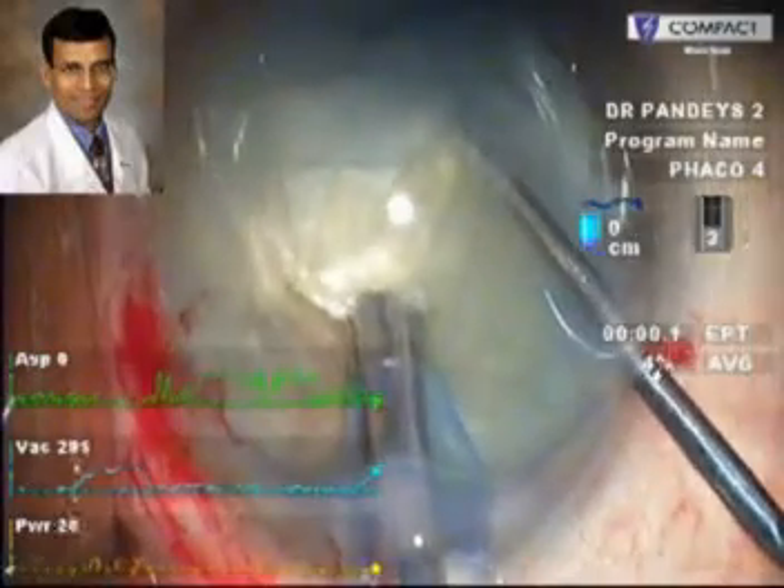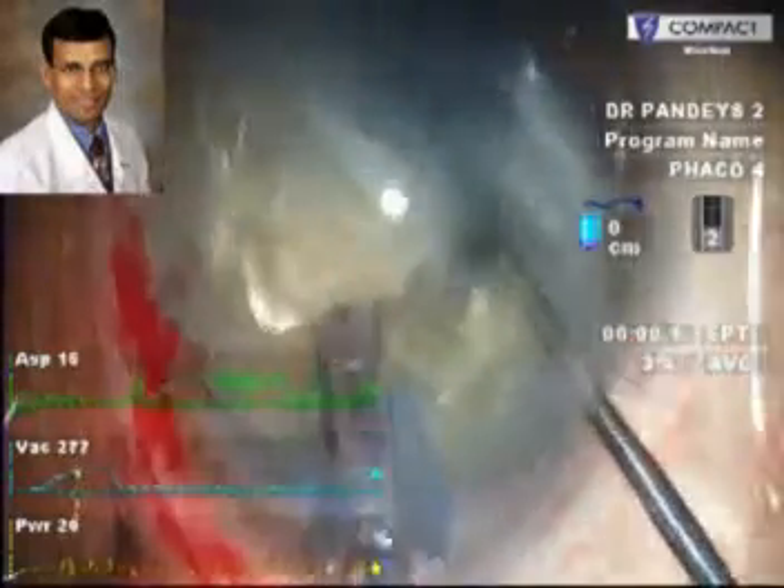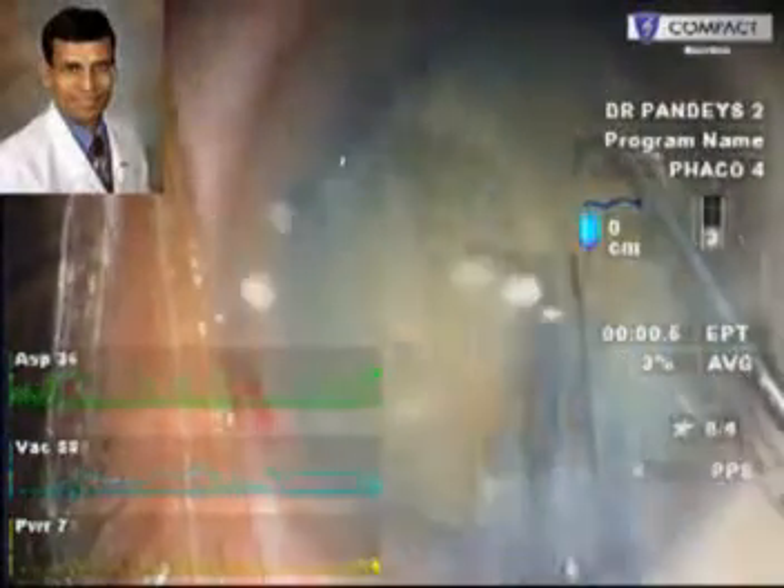Here it is an AMO compact machine that we are using for phacoemulsification, which we have found to be very good for various kinds of hard and soft cataract, especially with the incorporation of the WhiteStar software.